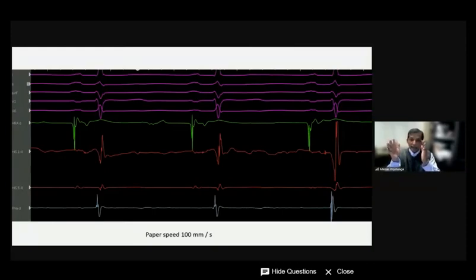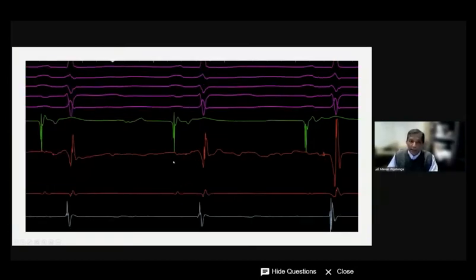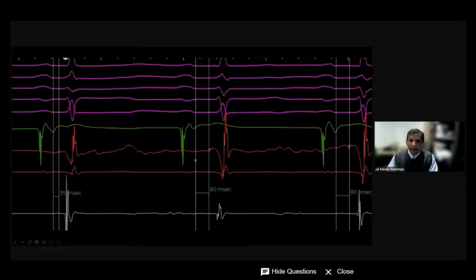It's not common to see this. So it's coming down from the sinus P, but the His bundle usually should not have a delay because the His bundle is a specialized conduction system. It should conduct fast, but there's a delay. And then when I watch and look at it, here it is, double signals in the His. And if I waited enough, I suddenly saw, look at this one, P, QRS, here the PR interval gets longer. And corresponding to that, this intra-Hisian delay got longer. This is not in the AV node, it's below the AV node.